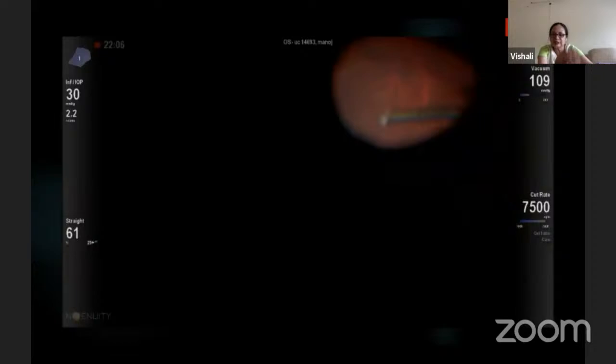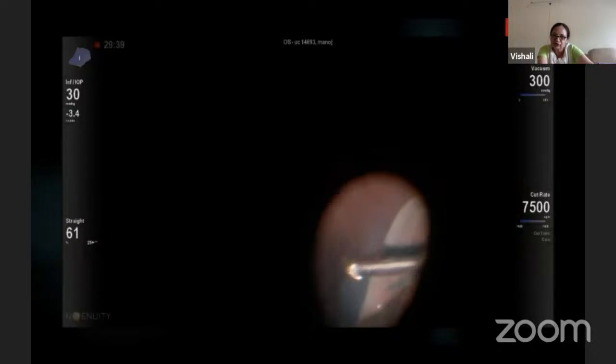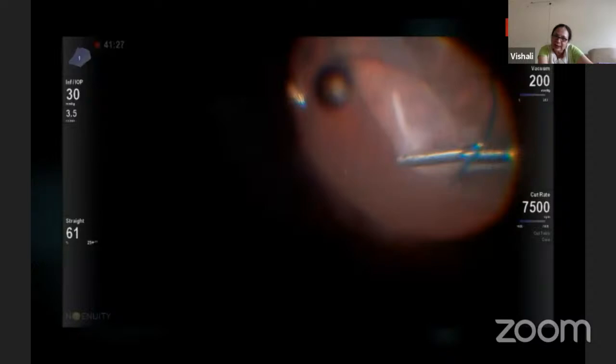But honestly, this was more of a therapeutic procedure where we just had to remove the hair, and it did not have any diagnostic challenge. So the hair, there were two hairs, I think. As you can see, one of them was in the vitreous, which was just cut with the help of the cutter after the scleral indentation in the periphery, so it came out. There was another one which was lodged here, and I just teased it later with the forceps, removed it from the underlying vitreous where it was embedded.